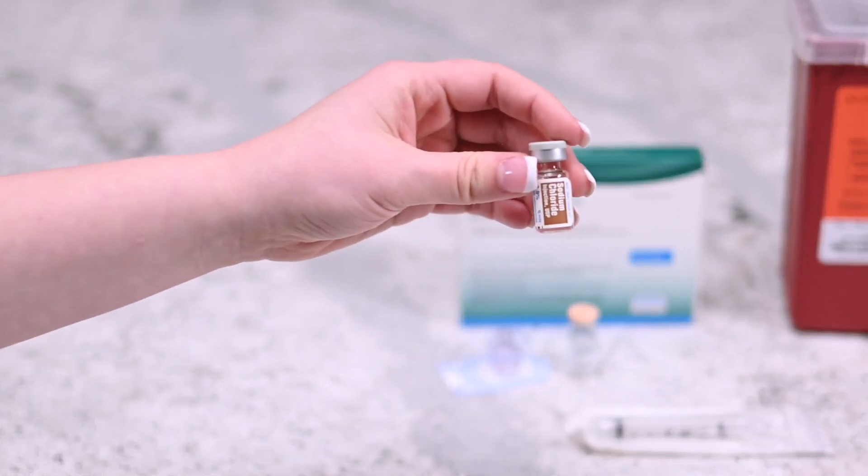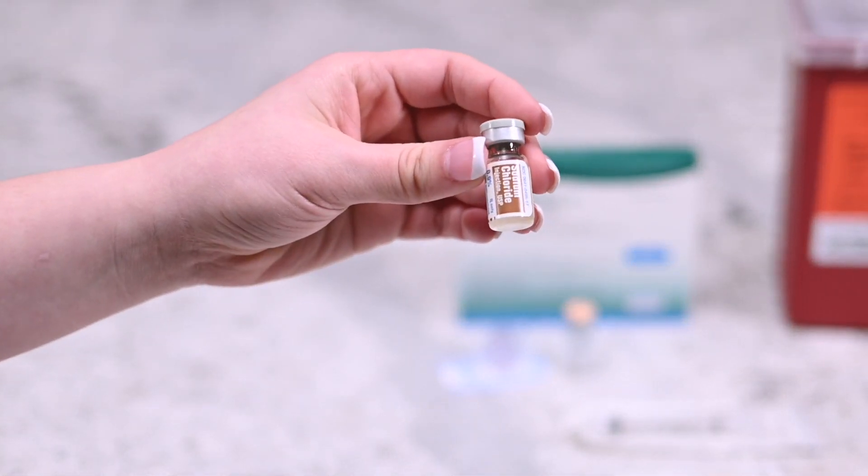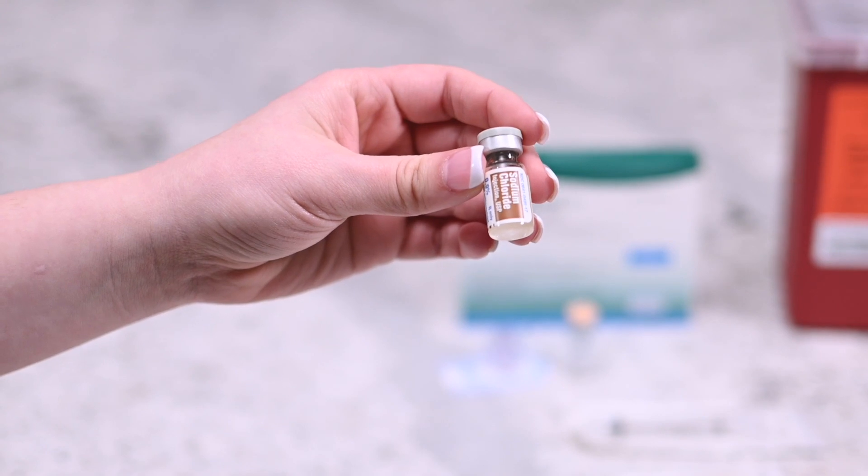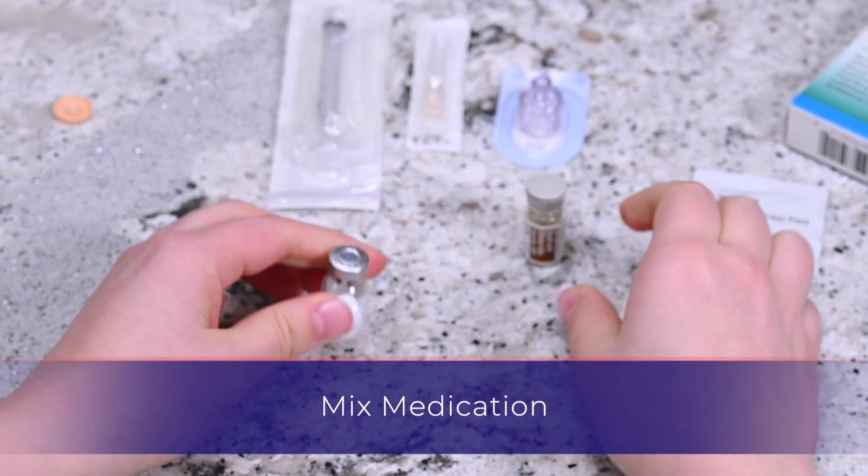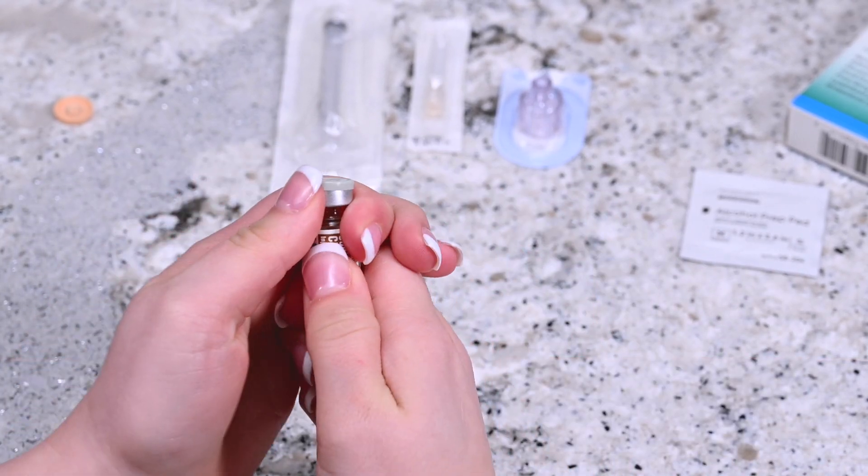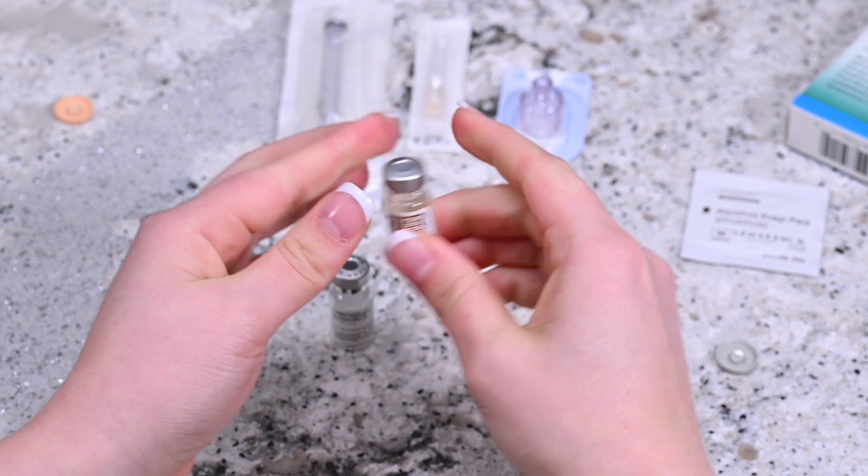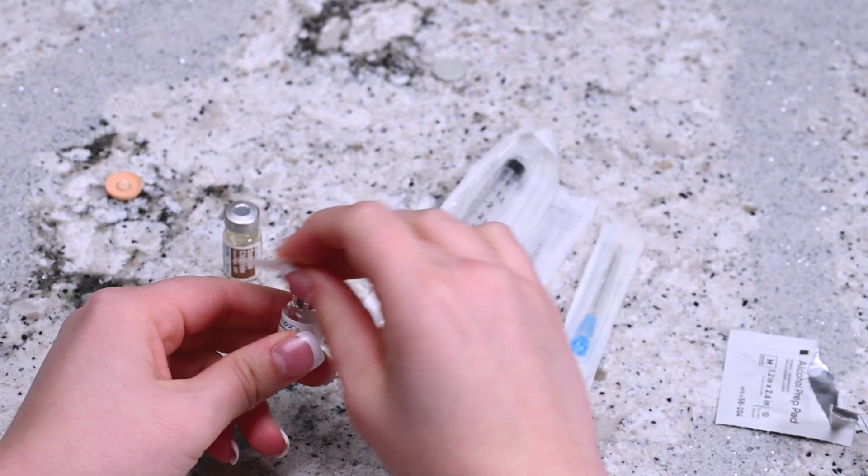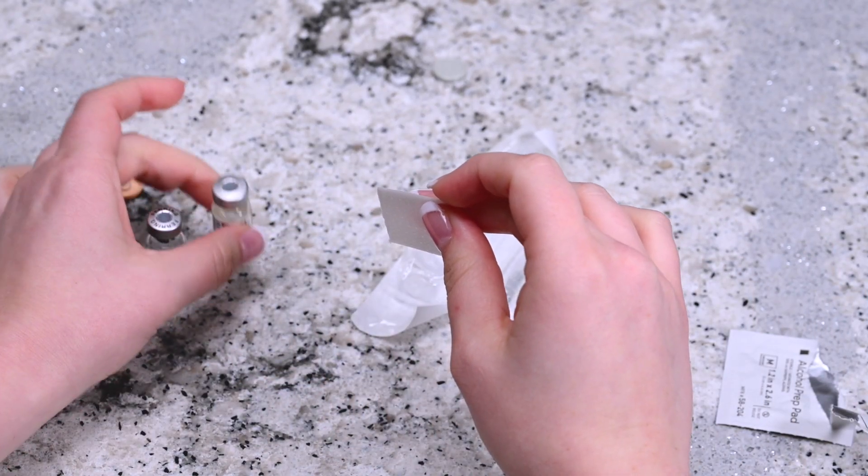Check to make sure that the vial of sterile diluent does not contain any free floating particles. Remove the cap from the vial of Menopur powder and the vial of sterile diluent. Disinfect the top of the vials with an alcohol prep wipe.